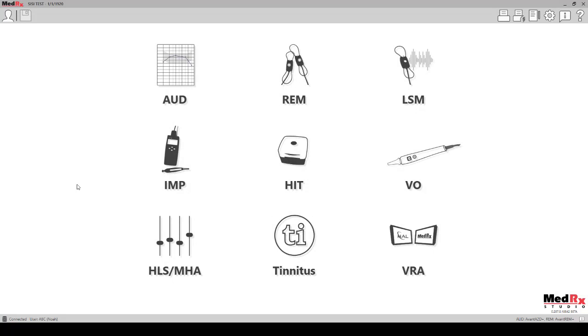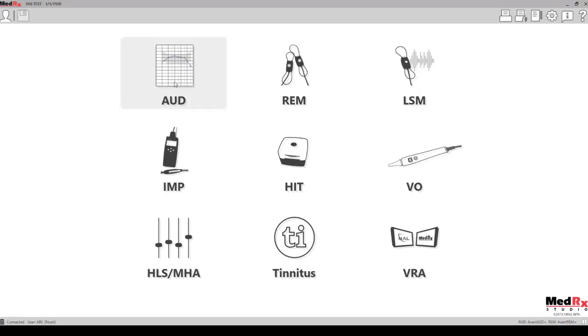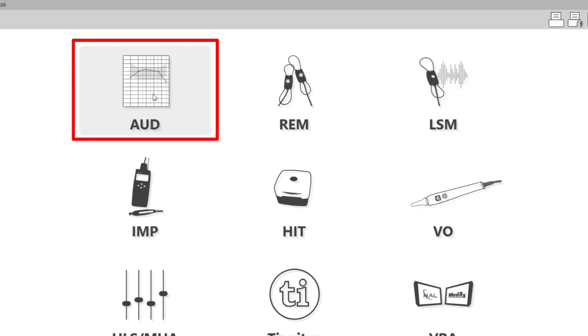Now we'll take a look at the Medrex Studio software and demonstrate how to perform the short increment sensitivity index test. This front page here is going to show you the different modules that are available within the software, but this is dependent on what equipment you have. For this test we want to click on the audiometry tab and the first screen that it brings you to is the tone screen.